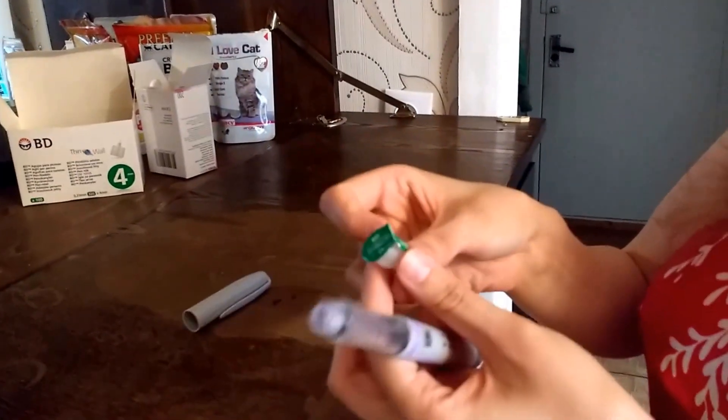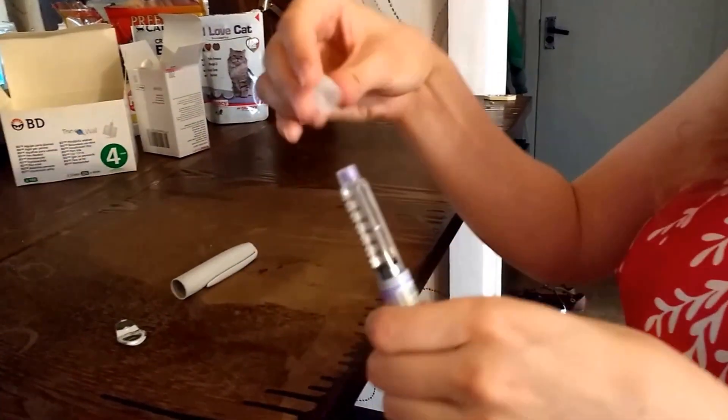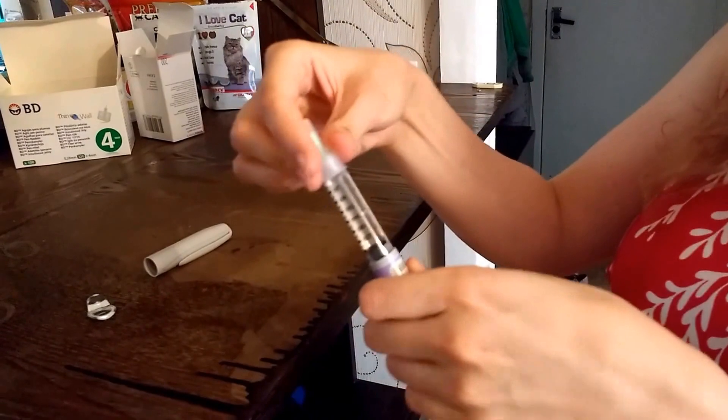Take one pen needle. Take the green bit off, then put it directly on the pen and close it.